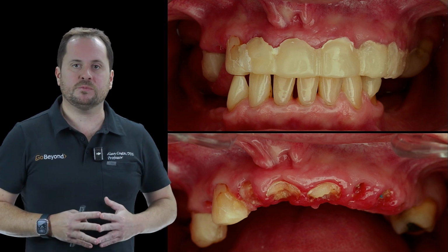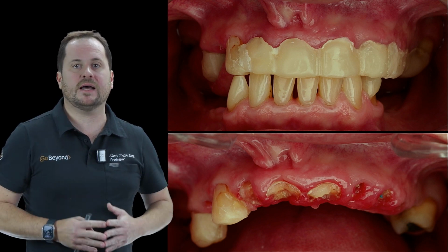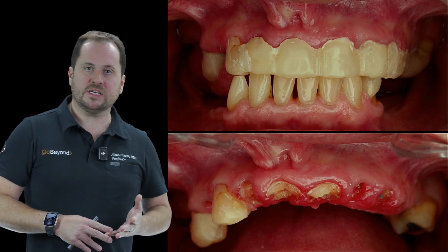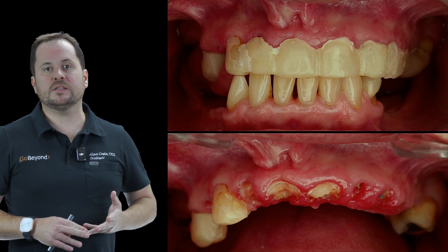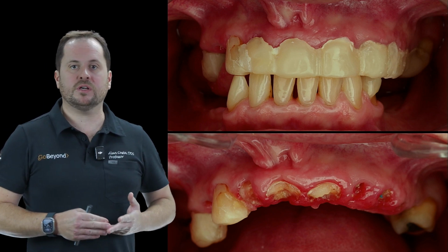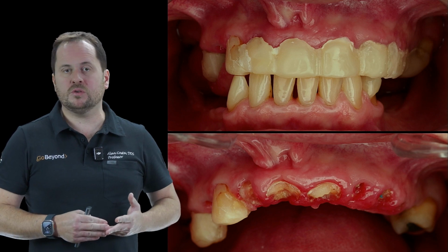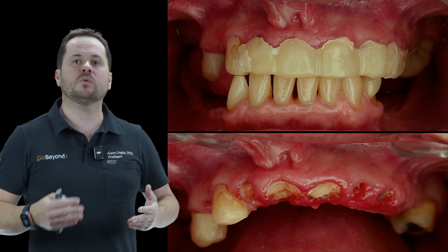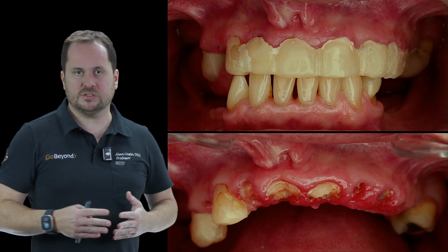What types of temporary prostheses can you make nowadays in a case like this? You can make temporary restorations with bisacrylic resin. You can make milled temporaries in the lab. But then we are talking, folks, about milled temporaries with quite high costs, considering that at this stage you will only be doing a medium conditioning for this patient.